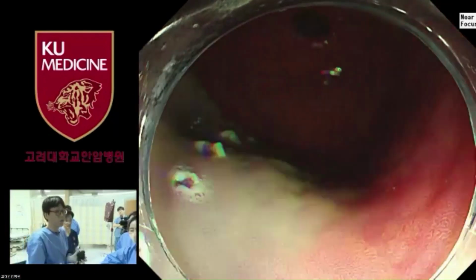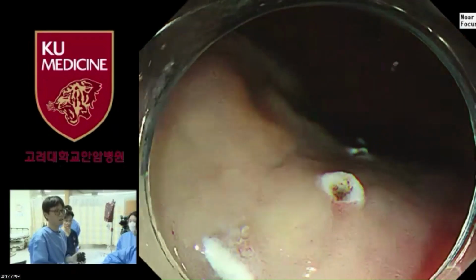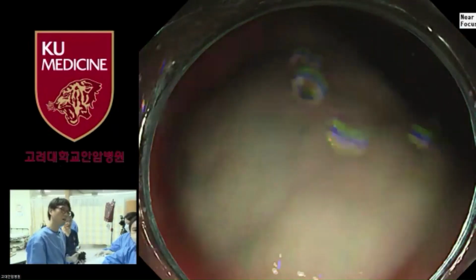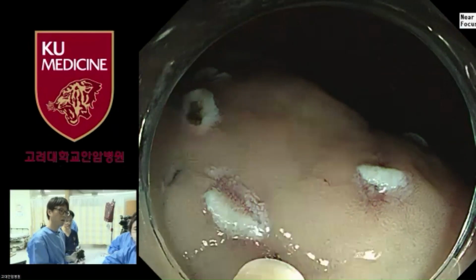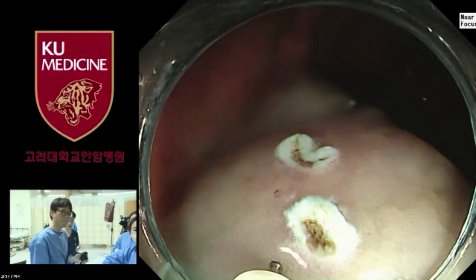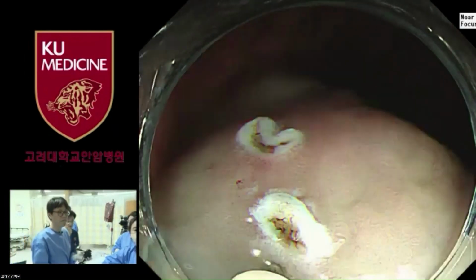But sometimes it depends on the endoscopist who doesn't want to repeat the submucosal injection during the procedure. In that case, some endoscopists just mix thicker solutions such as hyaluronic acid or glycerol.